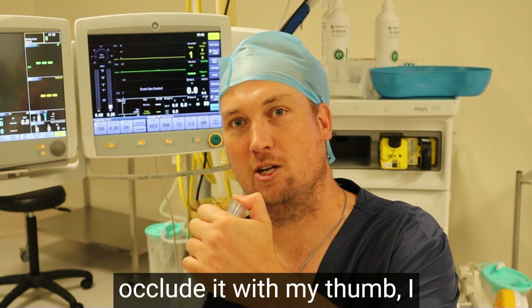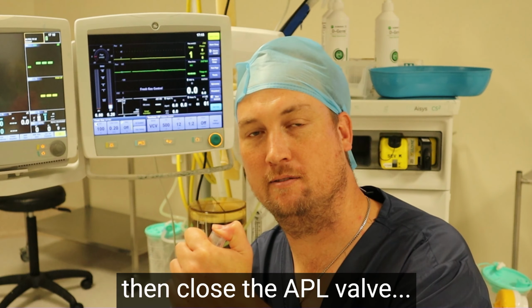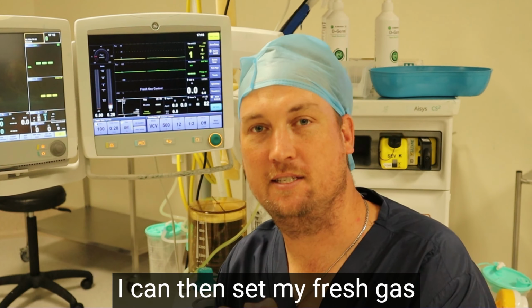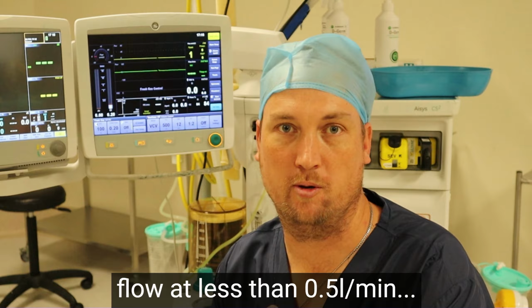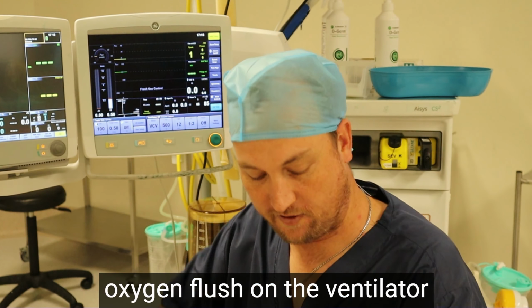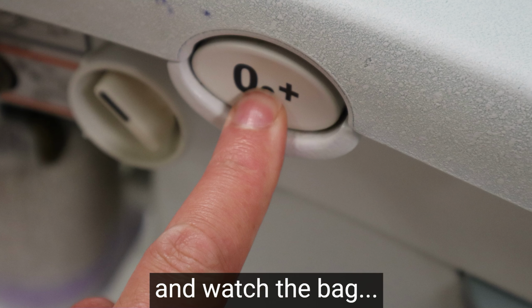Okay, so how I check the breathing circuit in between cases is I grab the end of the breathing circuit, I occlude it with my thumb. I then close the APL valve, so I close that to 70. I can then set my fresh gas flow at less than half a liter per minute, so I set that on the ventilator. And then I can press the oxygen flush on the ventilator and watch the bag.